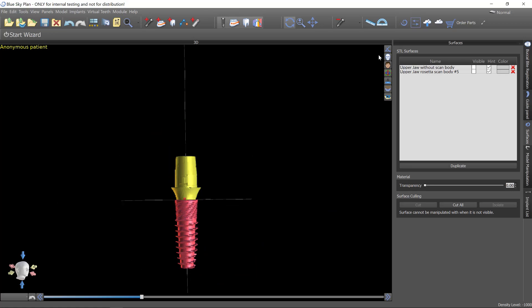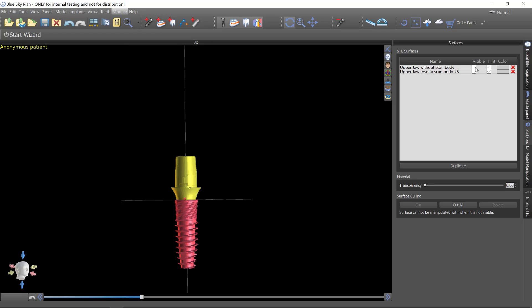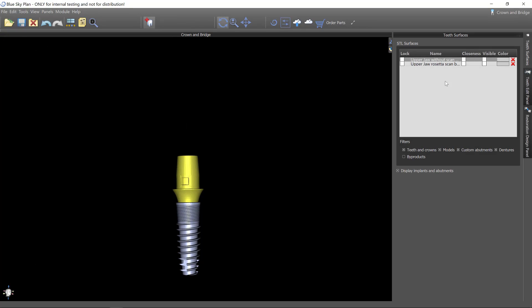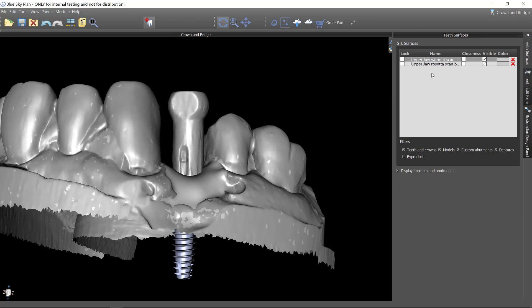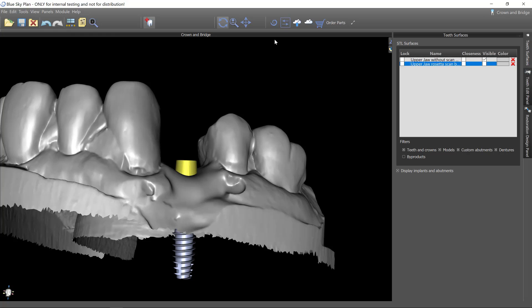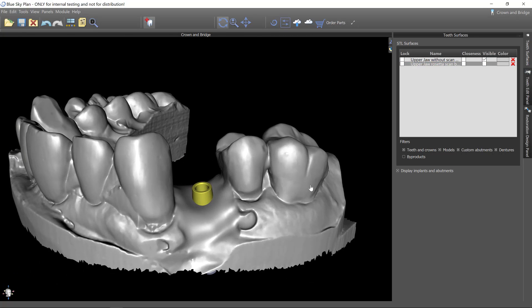So at this point I would go over to module and switch to crown and bridge. And we can turn our models back on now. I don't need the one that has the Rosetta scan post. I just need this working model.